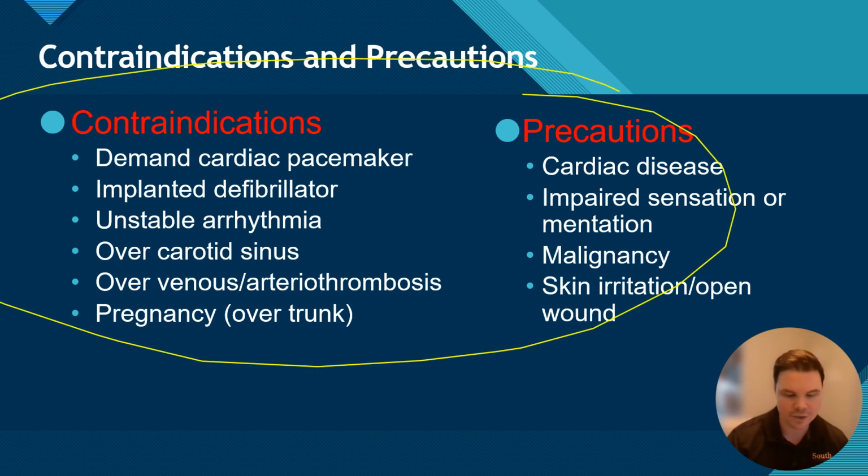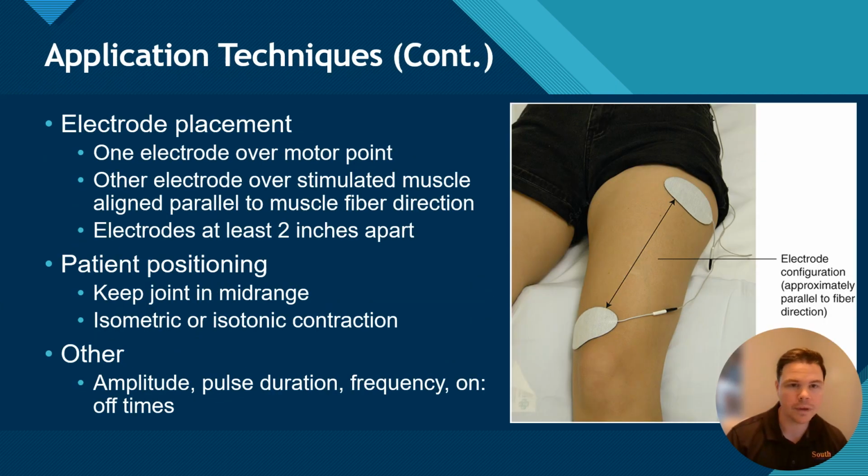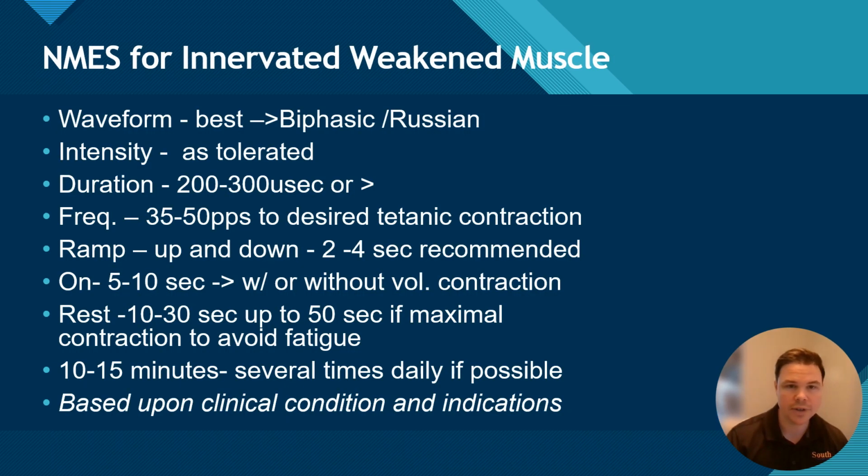Know the precautions, the contraindications. Go to your PowerPoint stuff that I printed out for you. Look at those. How to apply the electrode placement, these just practical motor points, things of that nature. This is all in your printout that I gave you guys. And what to use in terms of duration, frequency, ramp up time. Know that chart backwards and forwards.